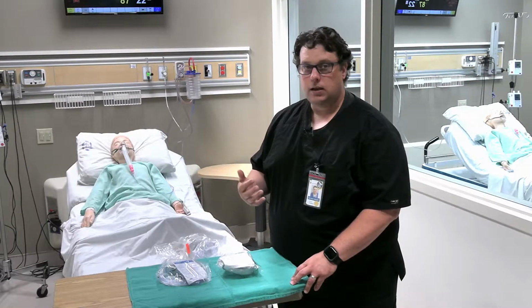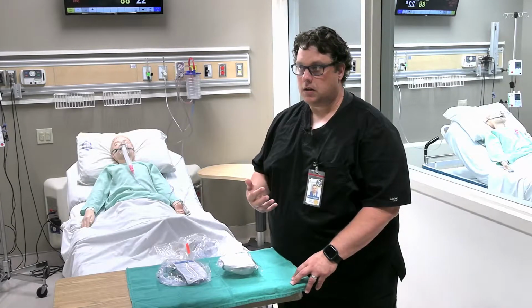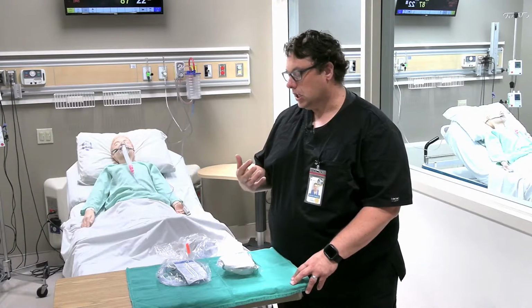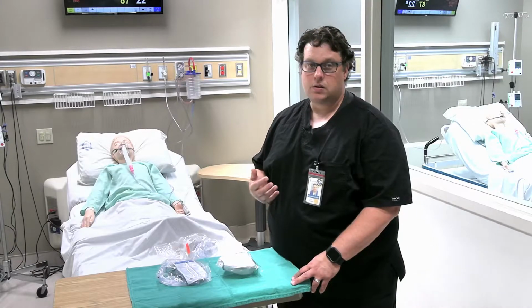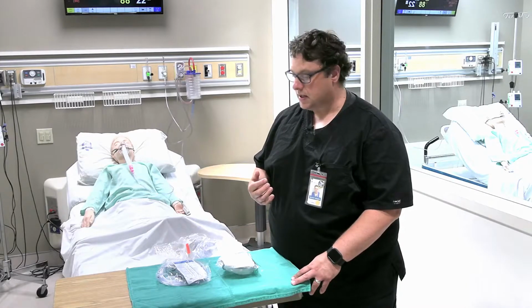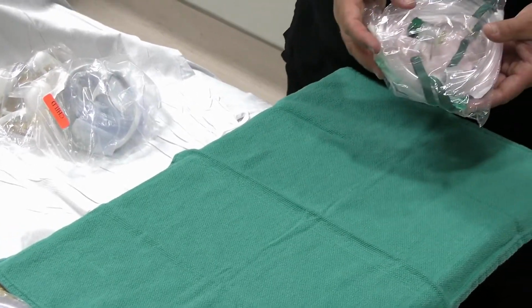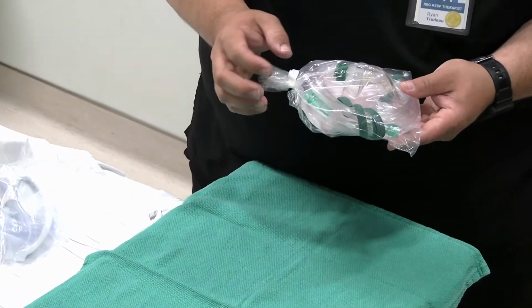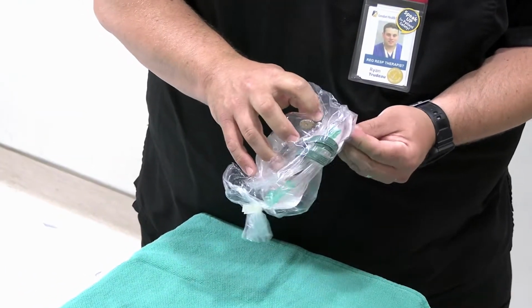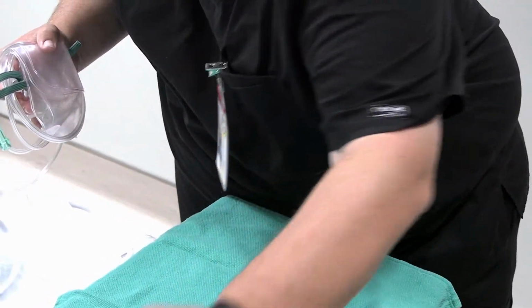So again, with the non-rebreather, some organizations will only stock the adult non-rebreather, and that can be used on any patient. The mask will be a little bit big for that patient, and that's okay as long as you're able to maintain their saturations with that device. But when selecting a device, if you do have a pediatric non-rebreather, that would be the best thing for that patient. So just opening up the package here, most manufacturers have everything that you need already in the package.